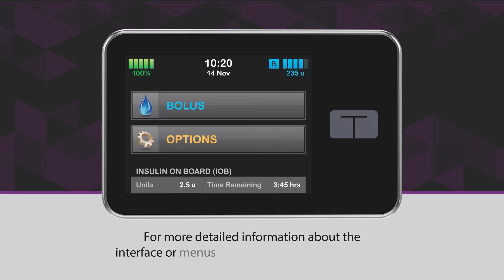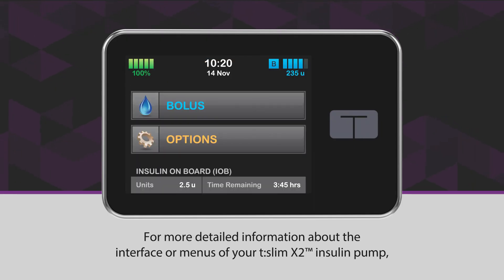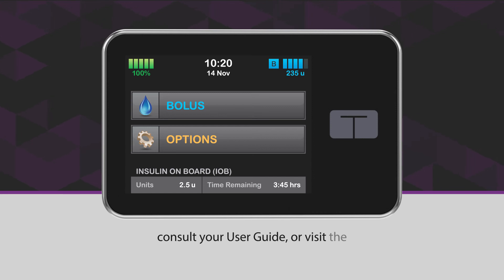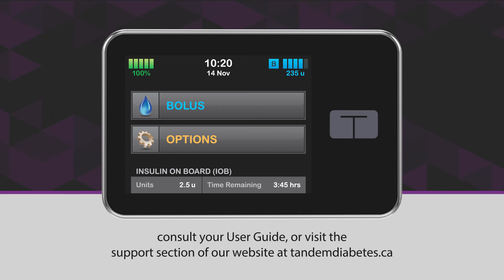For more detailed information about the interface or menus of your t:slim X2 insulin pump, consult your user guide or visit the support section of our website at tandemdiabetes.ca.